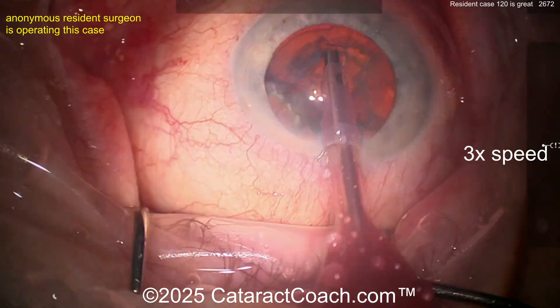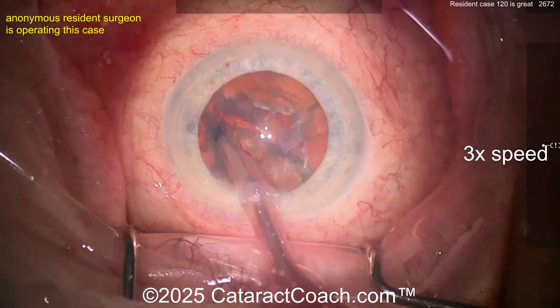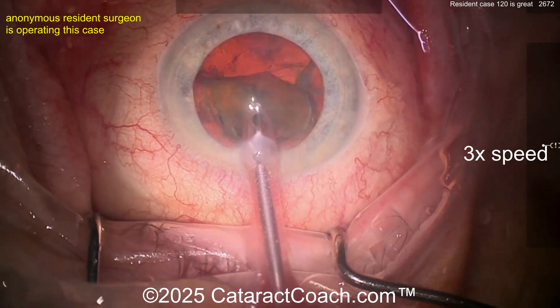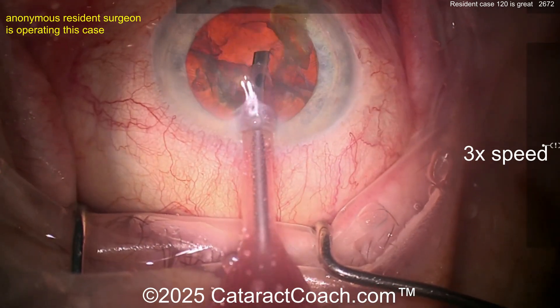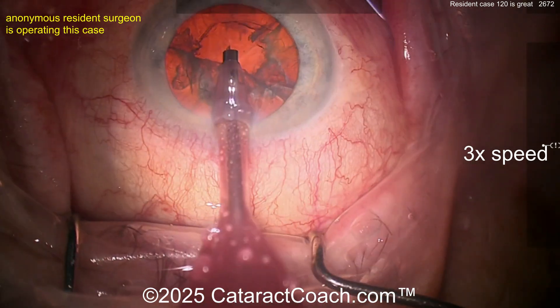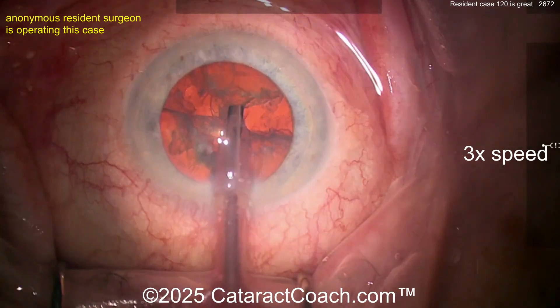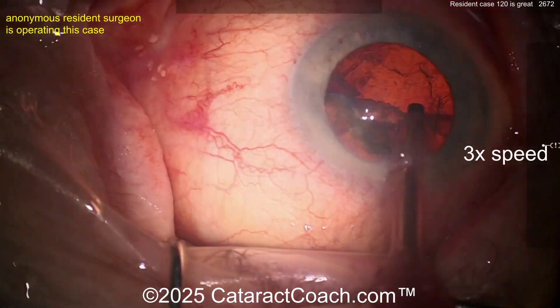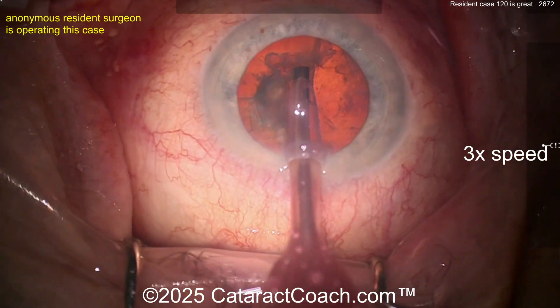If you want to learn how to do good cataract surgery as a resident, most residents start off with divide and conquer. I don't like this idea of taking the left hand out of the eye, because that left hand is important — you're going to be a chop surgeon at some point and you need to use both hands inside the eye. Only one hand on the phaco probe is needed. Here's where a chopper would have been helpful to rotate the piece around.